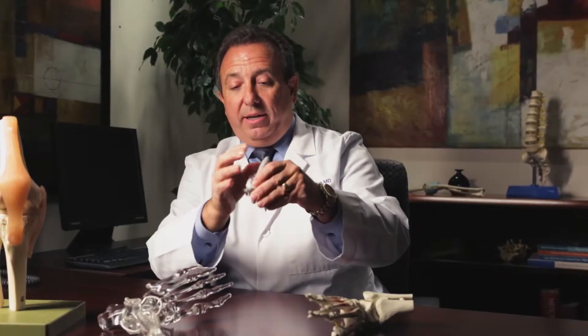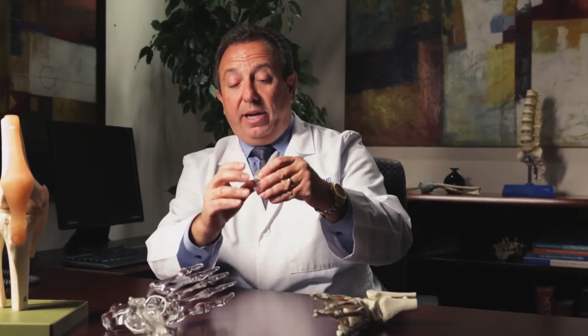This is a model of an ankle replacement. The gray is metal, the white is plastic. This part goes into the lower bone — the talus. This part goes into the tibia, and then you have motion. This glides in the same motion as the ankle. The ankle is a hinge-type joint, and the bone engrows into the area, making it stable and relieving the pain.